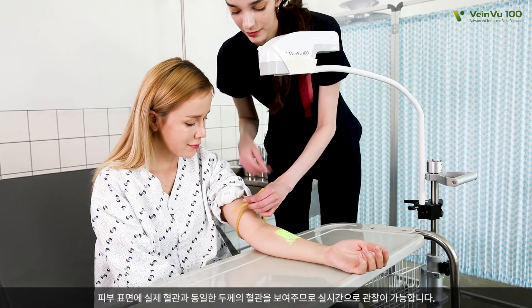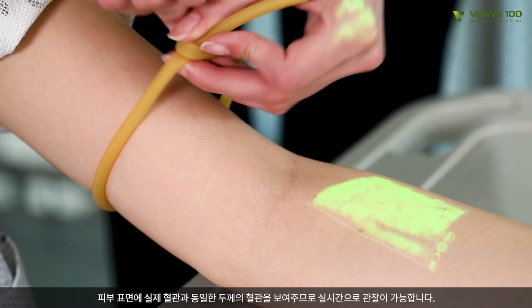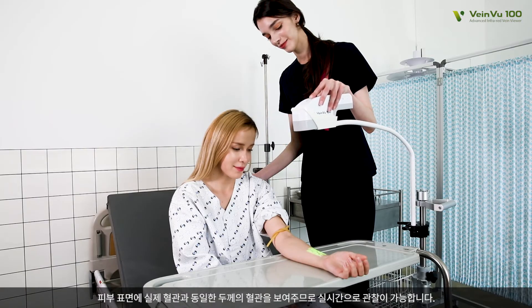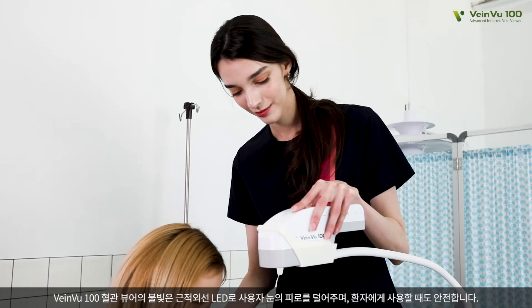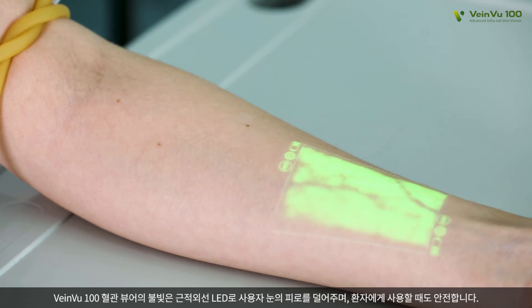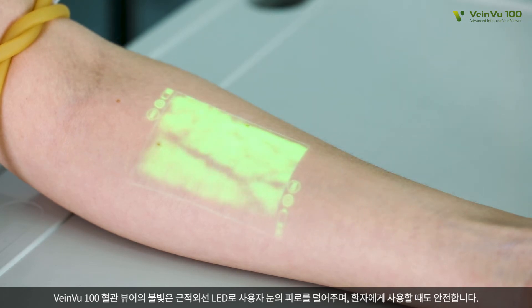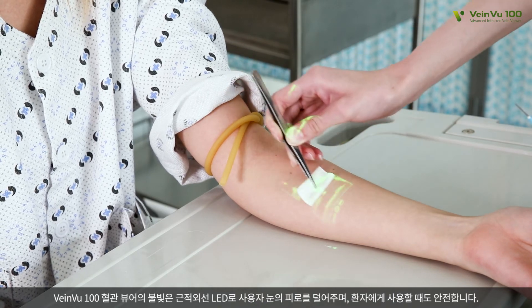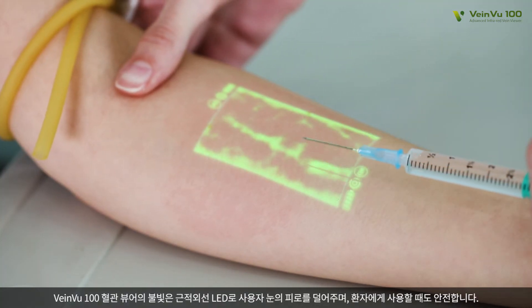The vein that has the same thickness as a real vein is displayed on the skin's surface. Therefore, you can observe it in real time. VeinVu 100 Transilluminator light is based on near-infrared LED. Therefore, it alleviates the eye fatigue of a user, and it is safe enough to be applied to a patient.